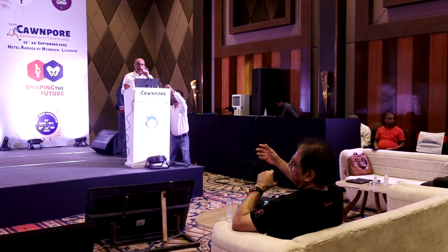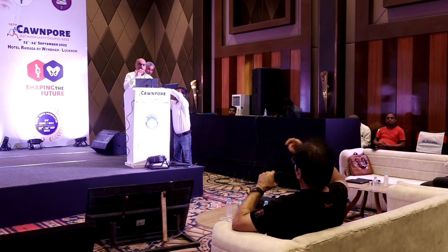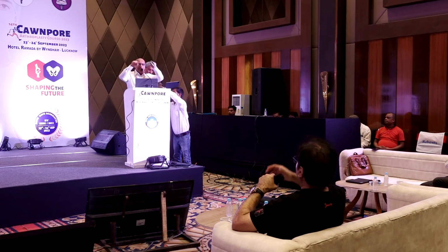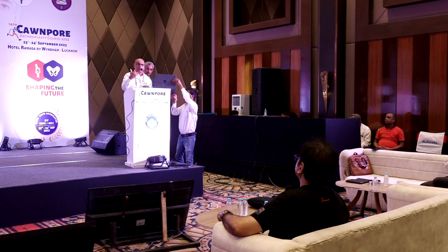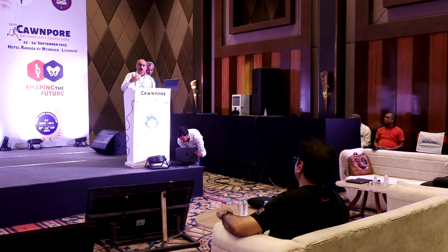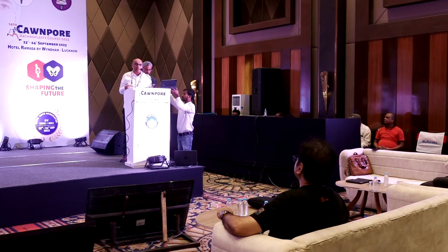Can it be done anywhere? Let us say you have a bleeder, you can't see it, can you just put it in? You need to have some sort of cavity around it. So this is a very good area where you can put it. And believe me, it will save you 20-30 minutes on the table, and the frustration of just sitting and waiting and doing nothing.